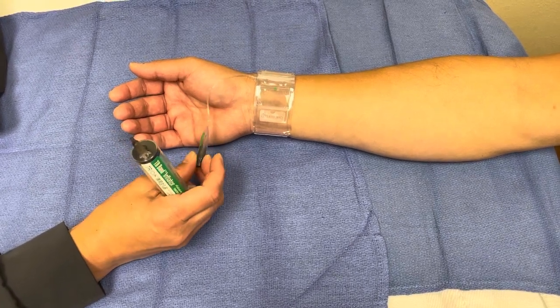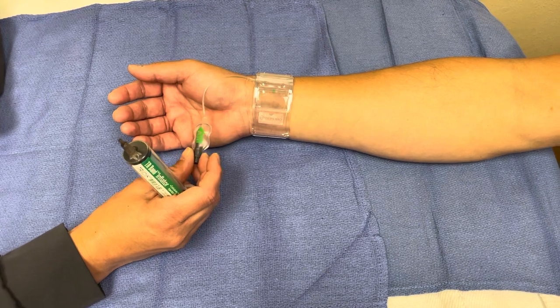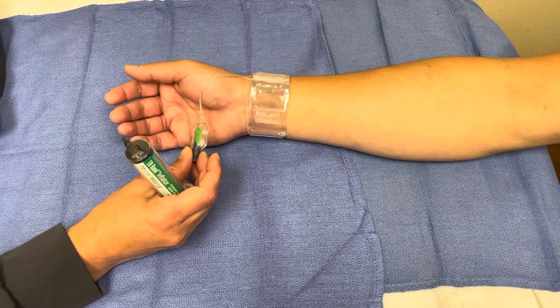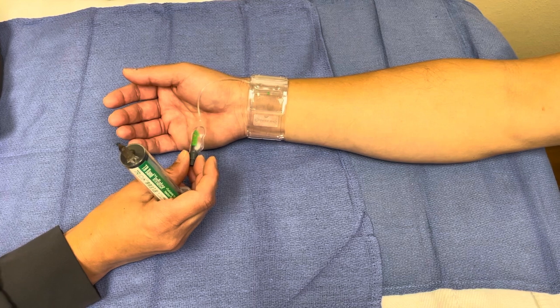We're going to follow the policy which recommends for diagnostic procedures, we will begin removing air one hour post-procedure. Post-procedure means when the patient returns to you, or two hours for intervention post-procedure — again, when they return to you.